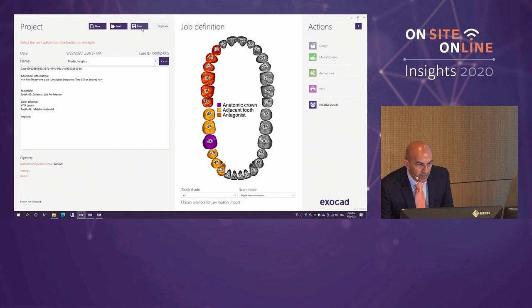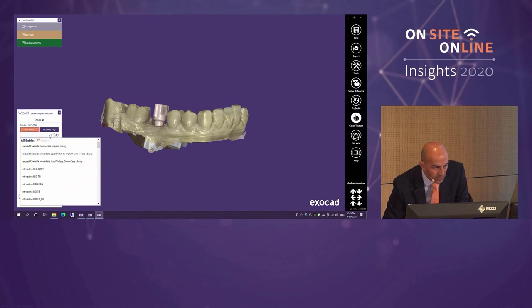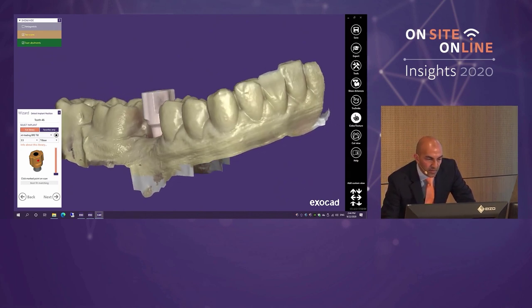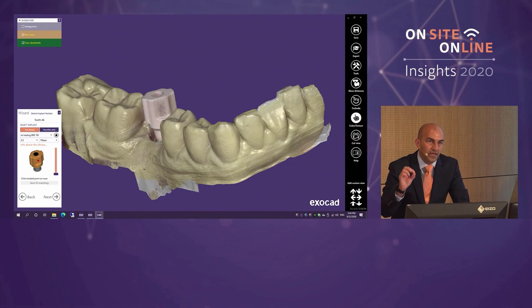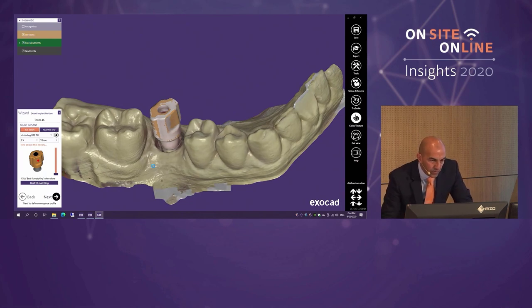First question from Exocad: which library are we using? We select the full library with the NT Trading / Bredent scan body, which appears in the window replicating what's in the mouth. I said earlier it's important to use an asymmetric shape that's easy to differentiate on each side. Rotating it around you can see it's curved on one side and flat on another. Exocad asks me to click on a specific point, then I click Best Fit Matching and it overlays its library reference data onto the actual data from the mouth.